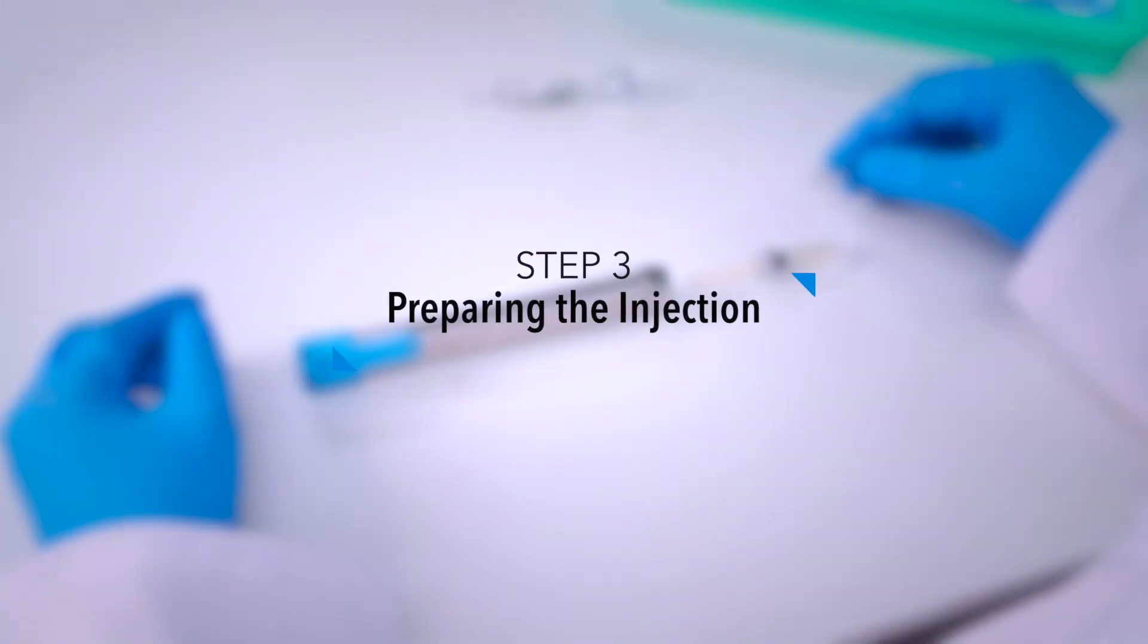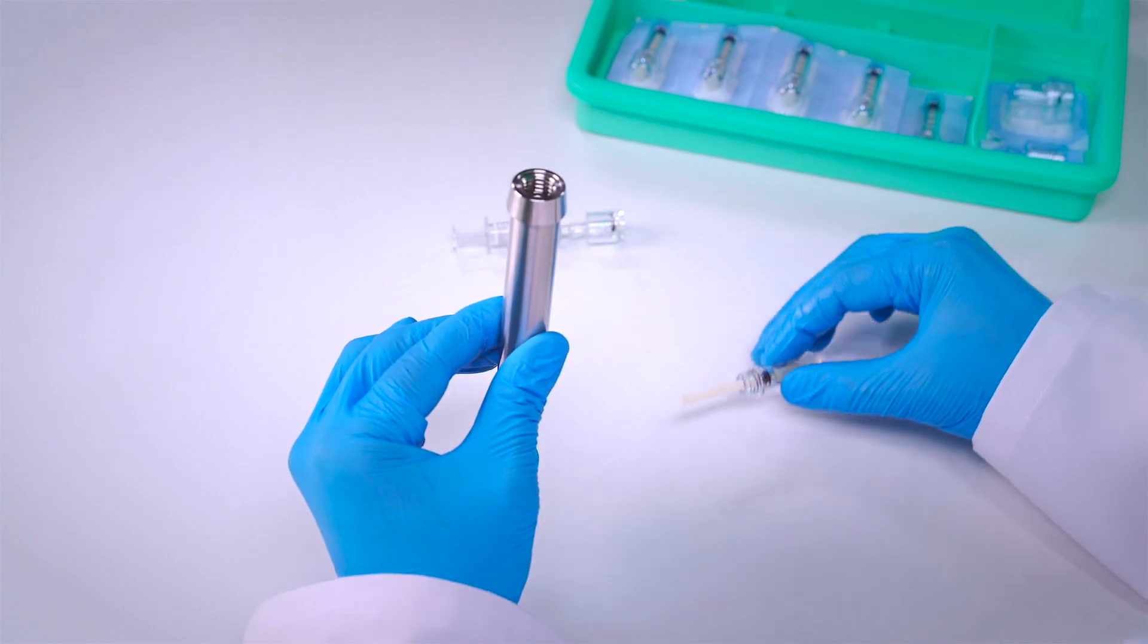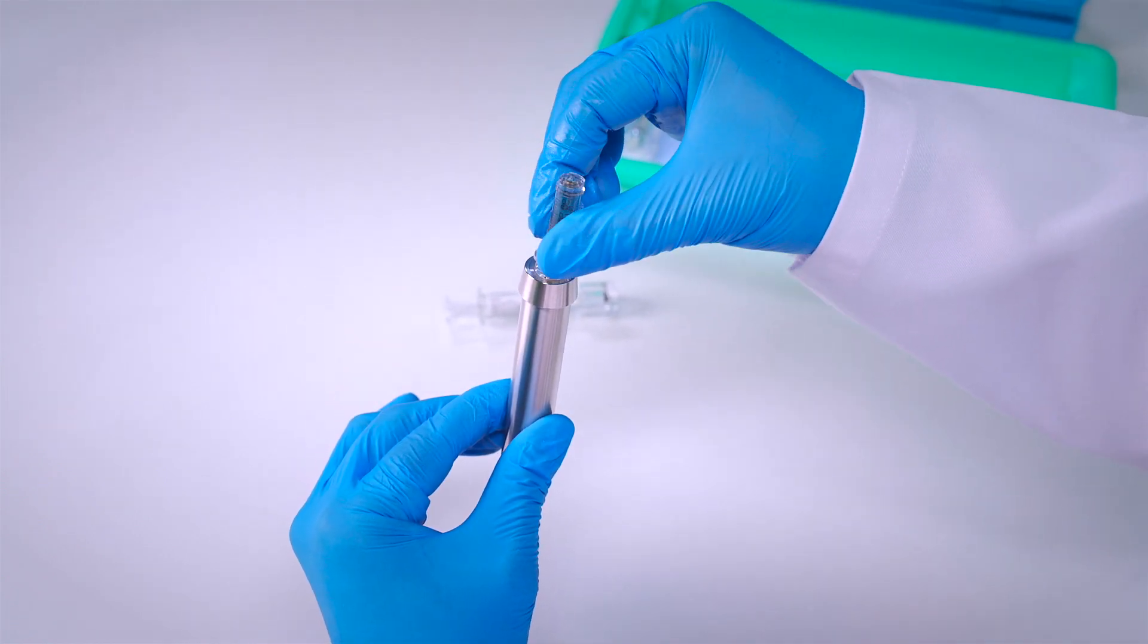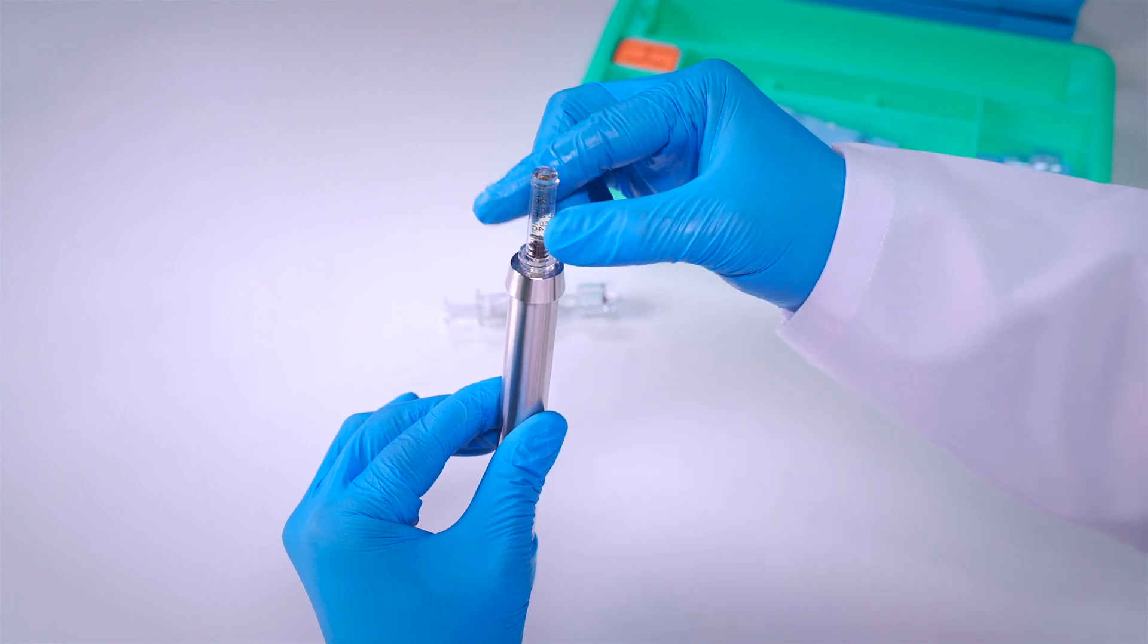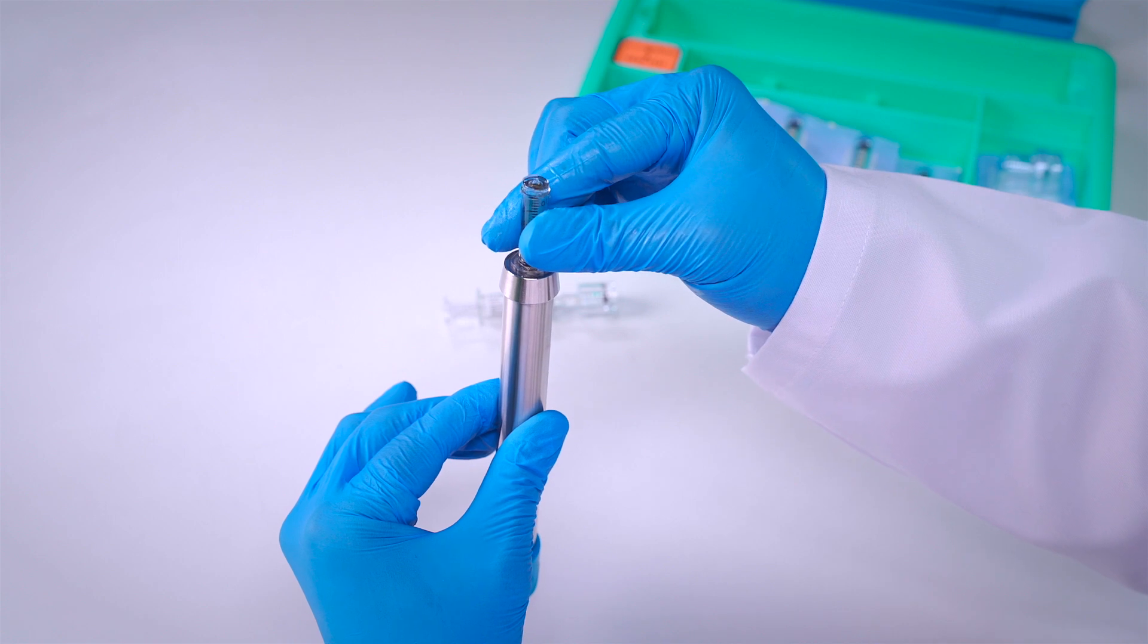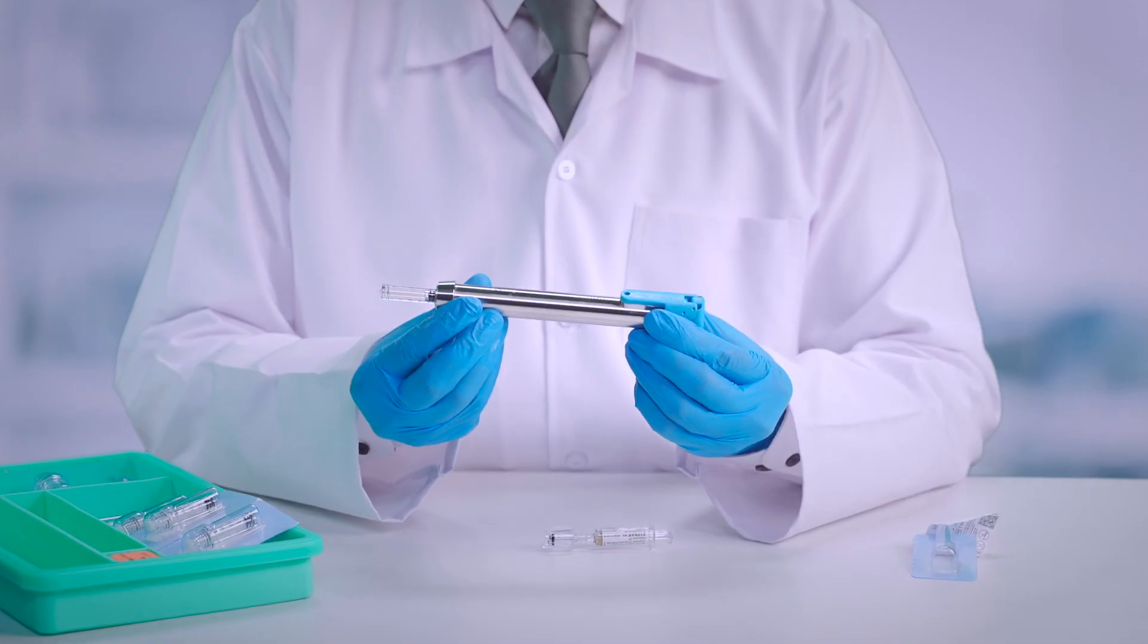Step 3: Preparing the injection. Insert the filled cartridge plunger down into the loaded NFIS device and turn it clockwise until secure. The system is now ready to use.